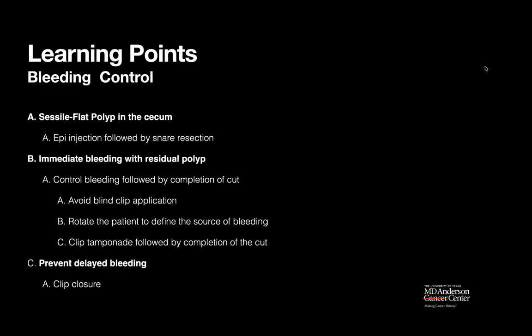the defect. The other thing is when you have a polyp that is dependent, like here, if the cut goes and there's no bleeding, there's no problem. But if the cut goes and gets complicated with bleeding, like we saw, a big vessel bleed, then you will struggle to find that bleeding source. So if that happens, rotate the patient or do something to push the blood away, and then treat the lesion. So these are the concepts that I wanted to share by presenting this case.